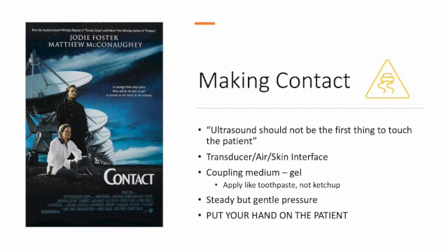And you can't get out of not putting your hand on the patient. You will touch your patients in this curriculum. I will not allow you to hover because you'll slide all over the place and you won't get good images.